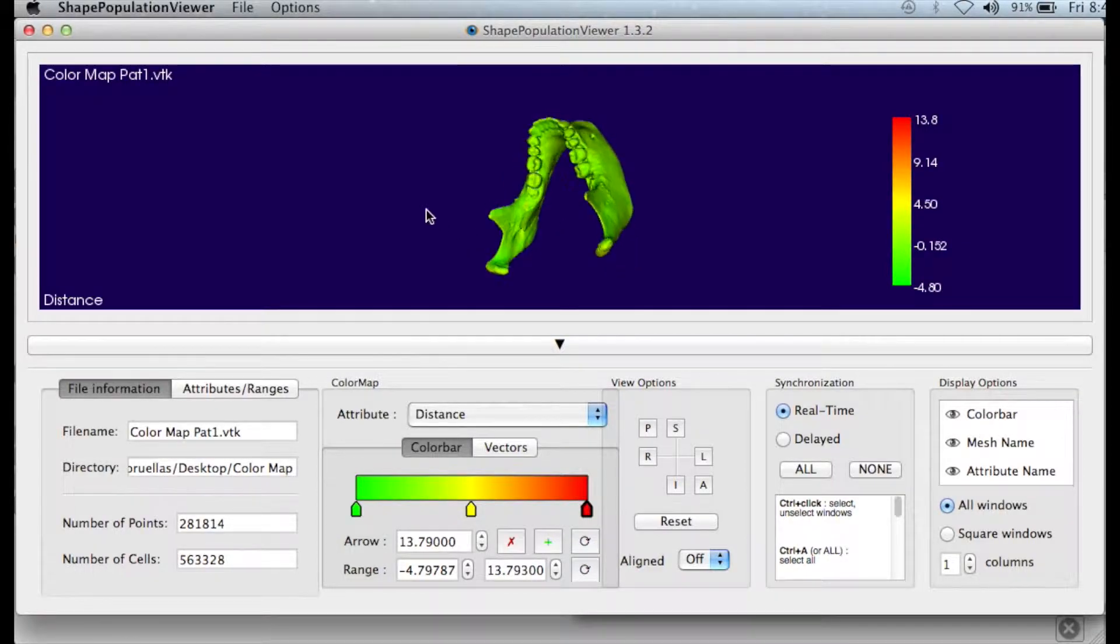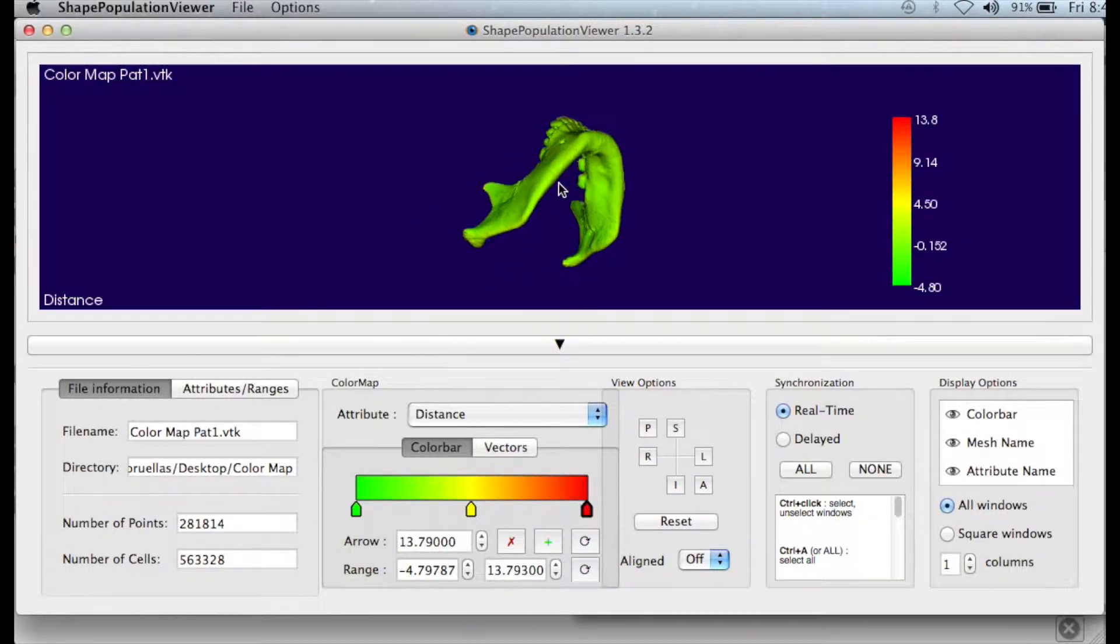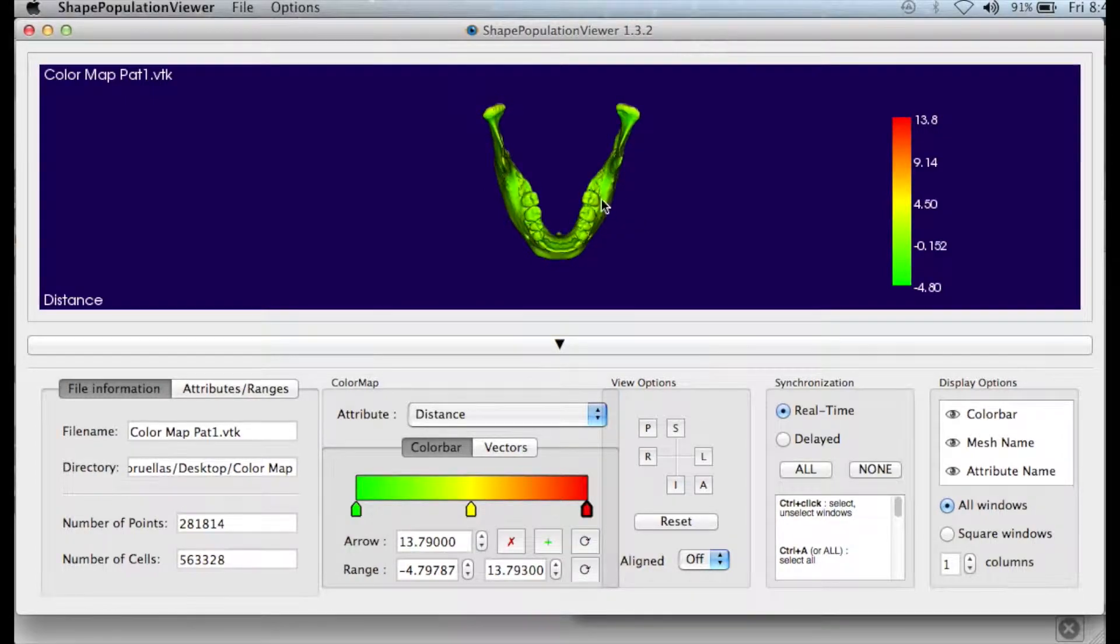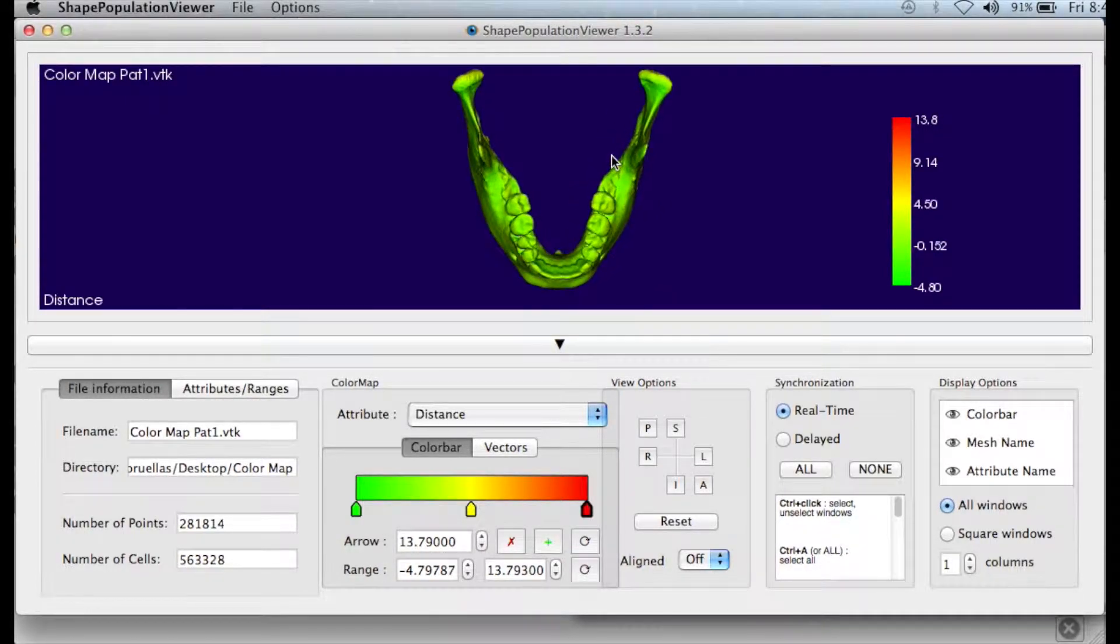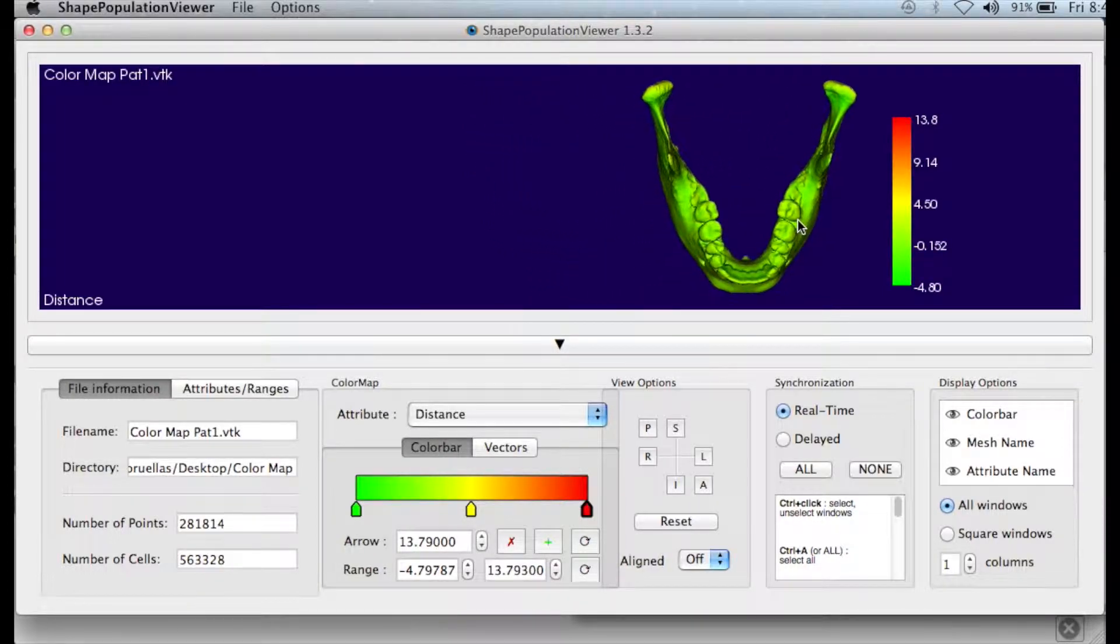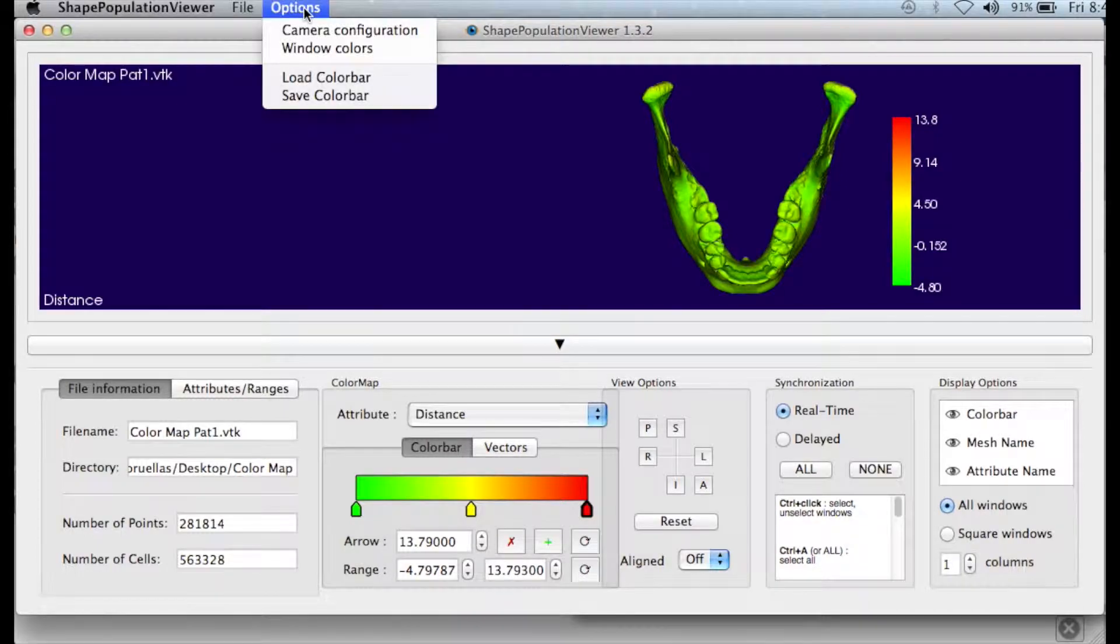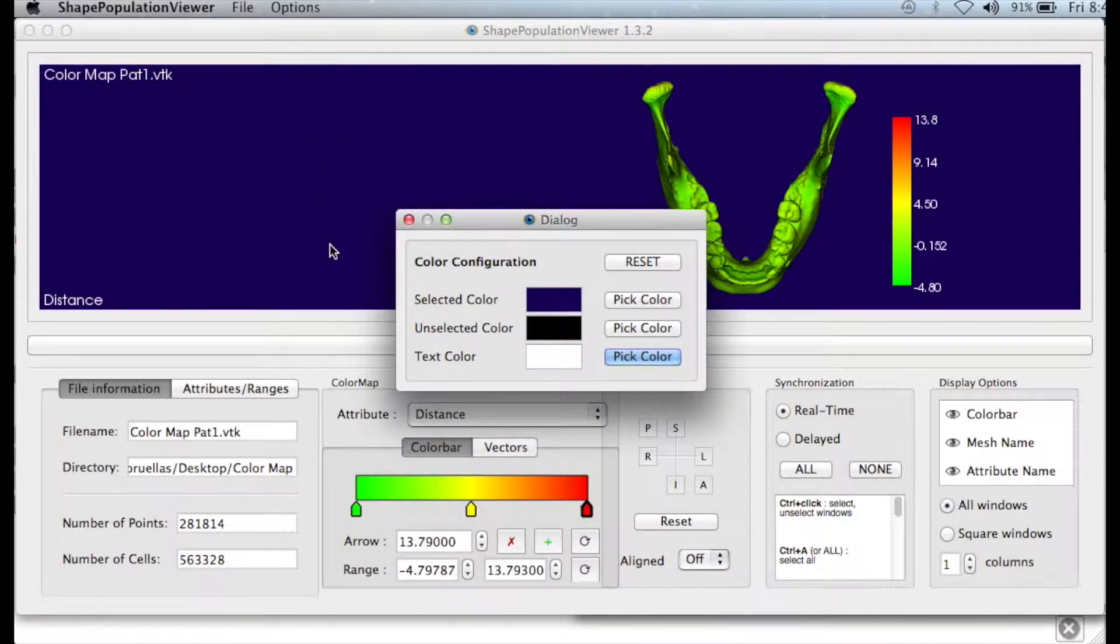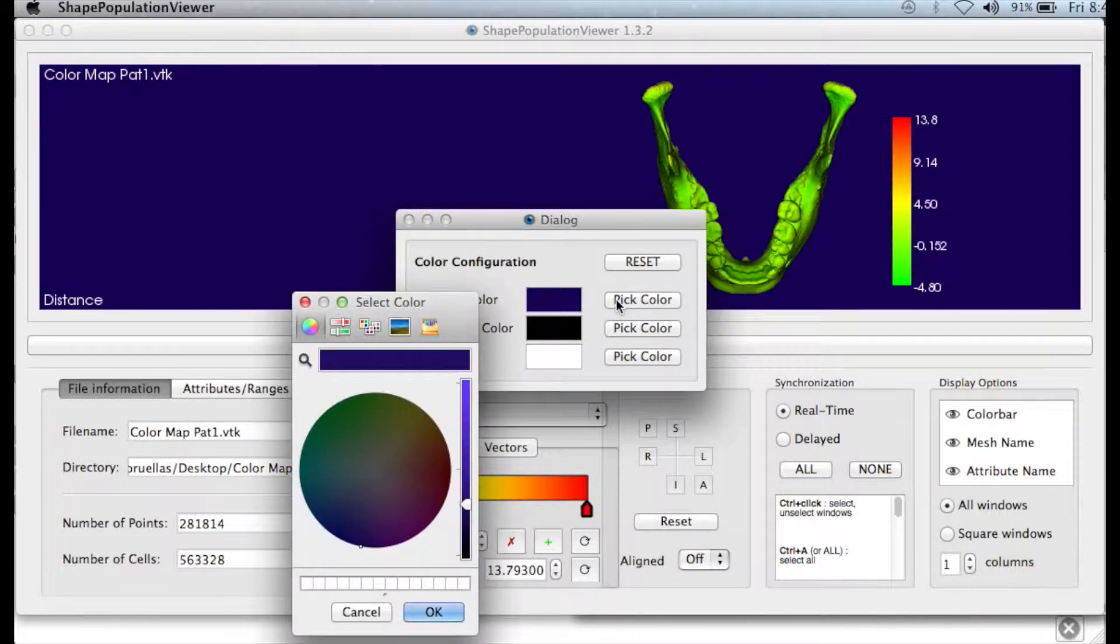Color-coded maps allow 3D analysis. In this color map, each color represents a different amount of change. Here, it's possible to change the background color and the text color. At the top of the page, go to Options, then click Window Colors. Here, we change the window color to black.